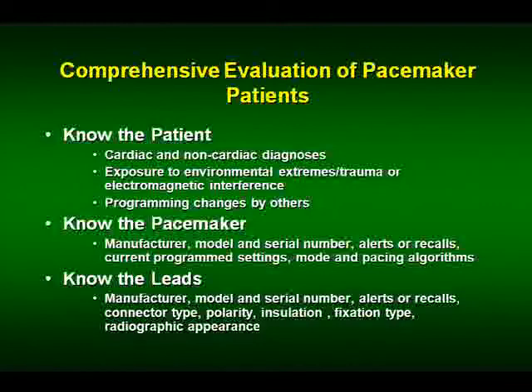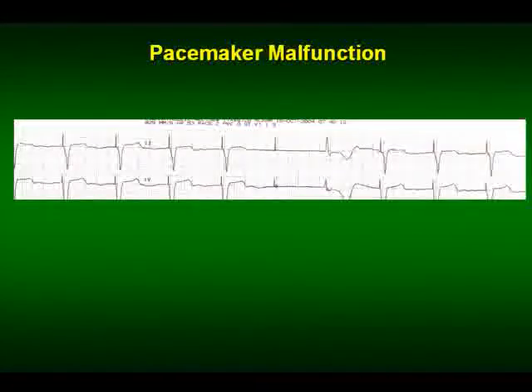And then you have to know something about the leads, because these are devices that can fail. And you have to consider, is this a high failure mode or a low failure type of device? And we get calls about this all the time, and there's enough in the literature and the newspapers about recalls. We'll say, oh my gosh, my device is failing, it's on a recall. Well, we can't take them out very easily, so you have to know a little bit about what the risks are with each type of failure.